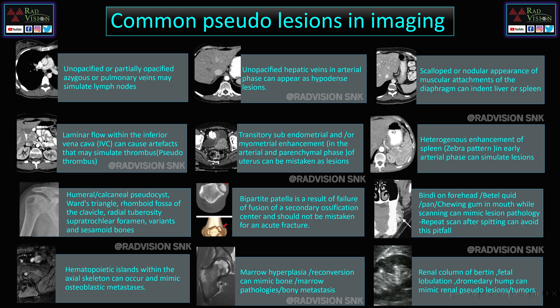We'll try to see some common pseudo lesions in imaging. First, unopacified or partially opacified azygous vein or pulmonary veins can mimic lymph nodes. Unopacified hepatic veins can mimic hypodense lesions. A scalloped nodular appearance of the diaphragm can mimic lesions and can even indent liver and spleen. Laminar flow in the inferior vena cava can mimic thrombosis.